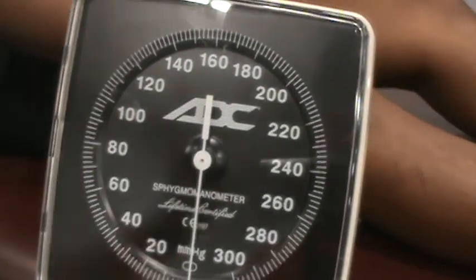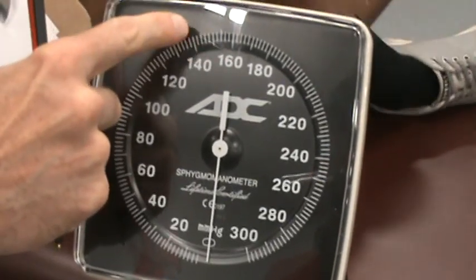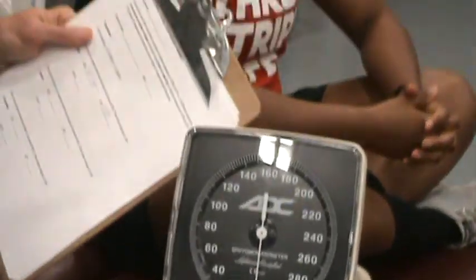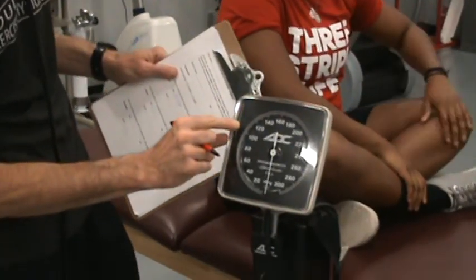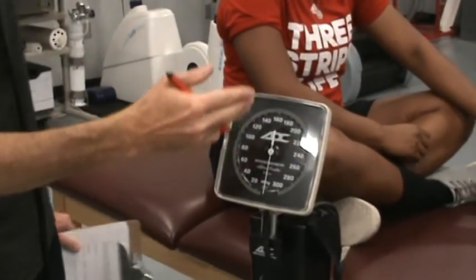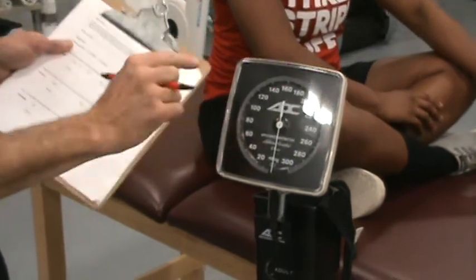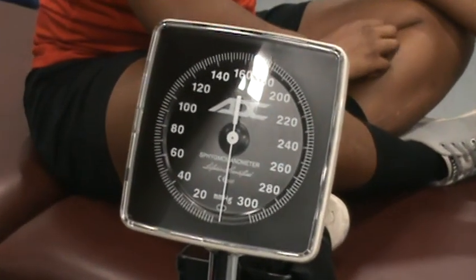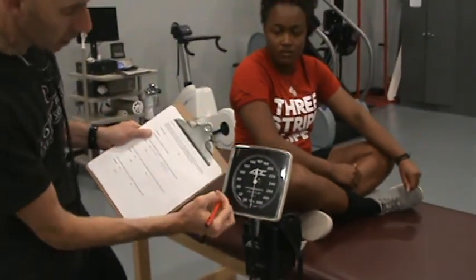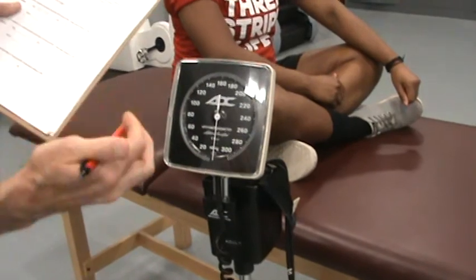I then heard a rhythmic, steady heartbeat as the needle continued to drop, okay? The sound quality is going to vary. It often gets a little bit louder as it gets closer to 100, and then it starts to get a little bit quieter as it continues to go down in pressure. And the last sound I heard was actually at 60. So where the last sound is, that's going to be your diastolic blood pressure. So again, that was about right here, okay? So I wrote down for her supine blood pressure, 118 over 60, okay? What you all will need to do for the lab is calculate her mean arterial pressure.